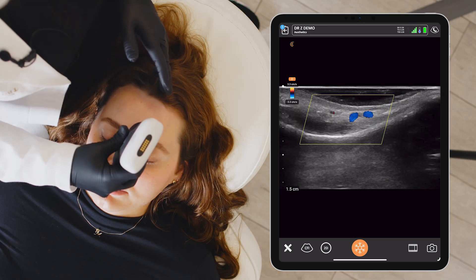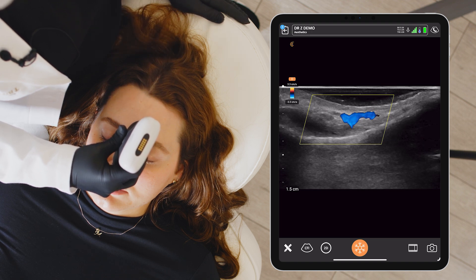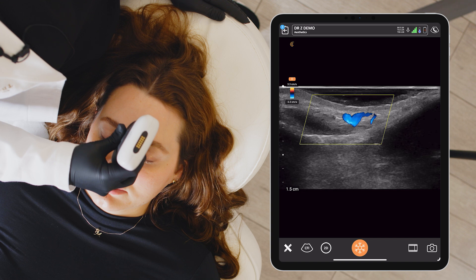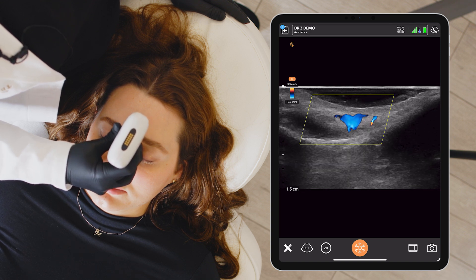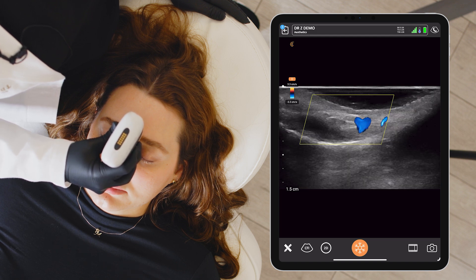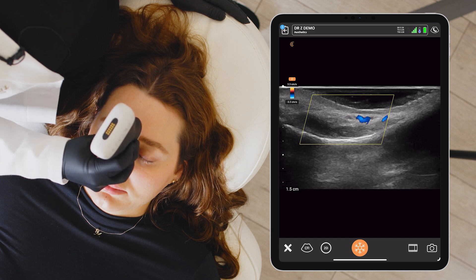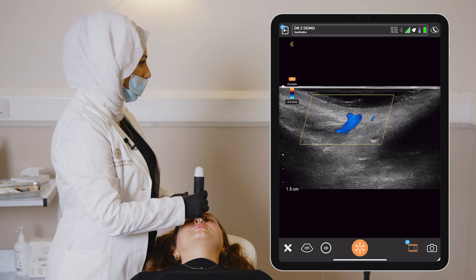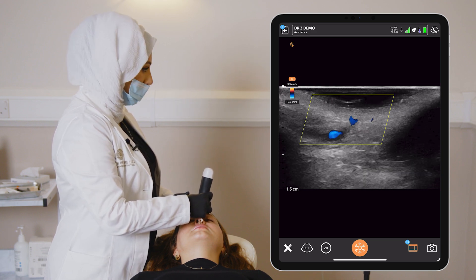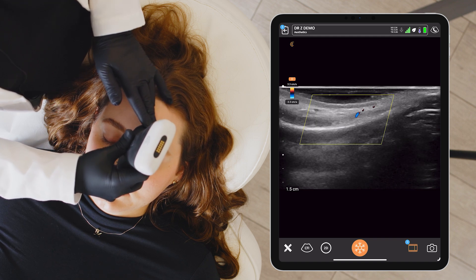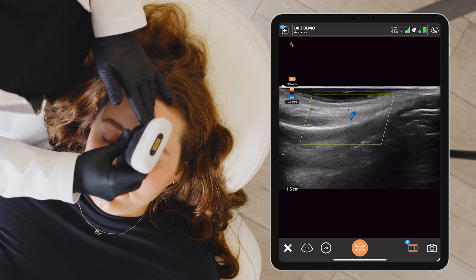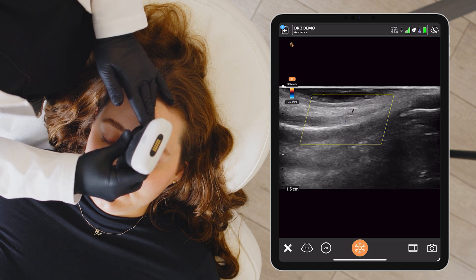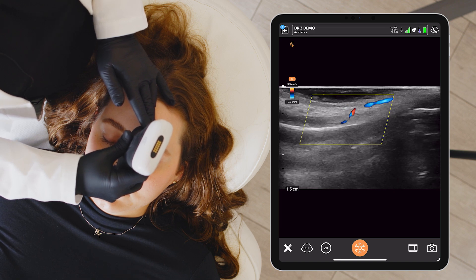There appear to be different vessels showing in different layers — in a deep layer as well as in the subcutaneous layer. This is the midline. When we look tilting to one angle it looks like this — that is quite vascular. As I come to the right hand side it gets a little bit quieter but it's still present. This is exactly the point that we want to inject. The different tilting motions of the probe reveal a lot more about the blood flow here. We start to see an appearance of vessels — at the beginning of the radix just before the dorsal hump it looks like it's in a superficial plane, and then as we go higher up into the radix the vessel courses through the layers deeper.